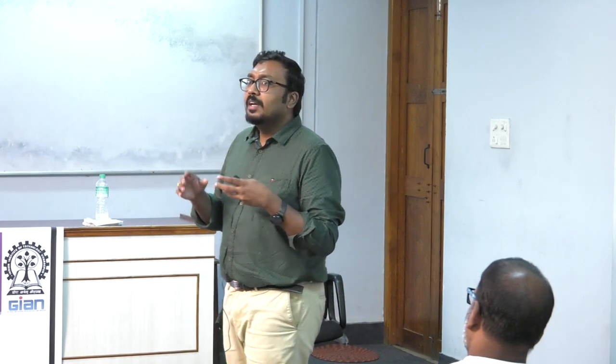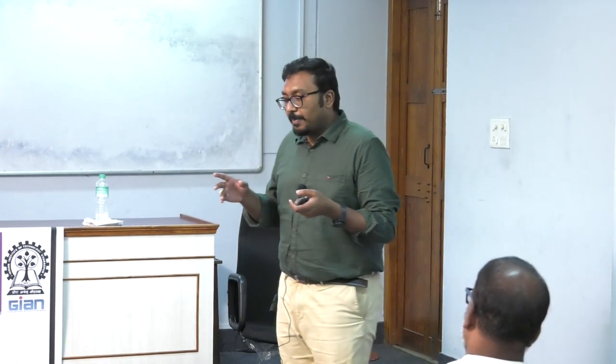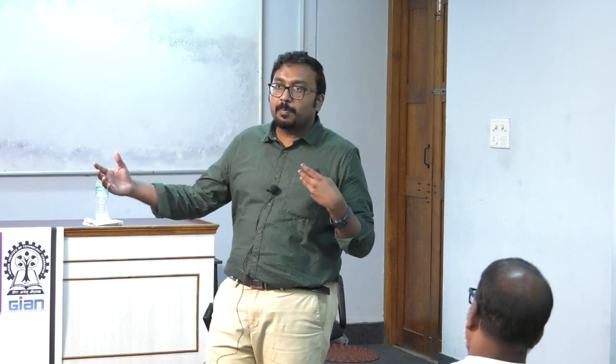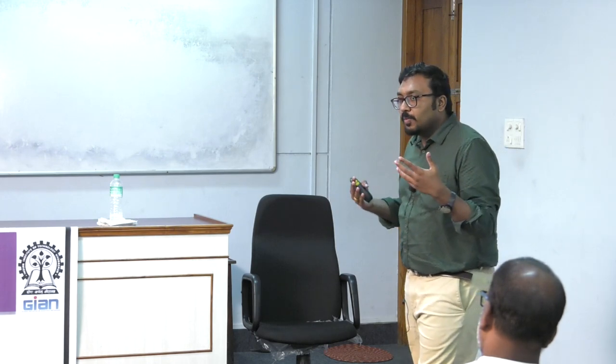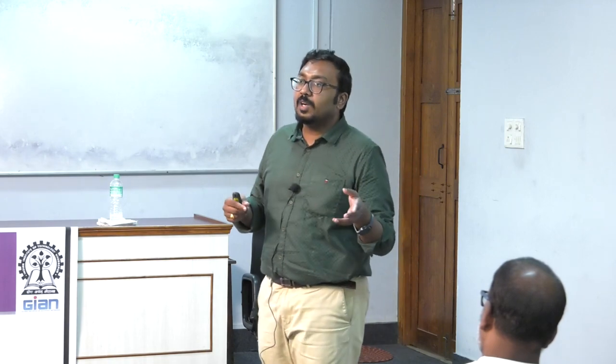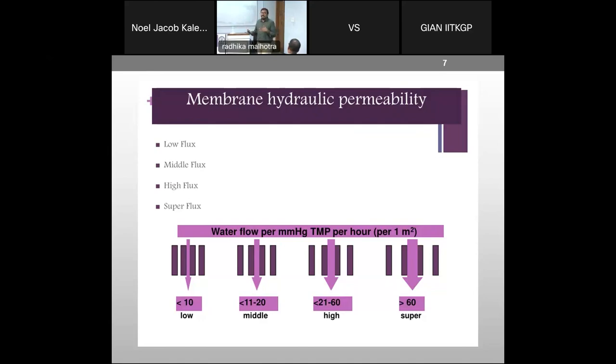So it is not like your normal ultrafiltration or nanofiltration, where if you apply much more force, you will get much more permeate. You cannot do that because you will kill the patient in the end. But you still want to remove as much water as possible per pass, because otherwise the patient is on hemodialysis longer. So there is associated fatigue, or any kind of reactions that occur when the patient is undergoing hemodialysis for much longer.